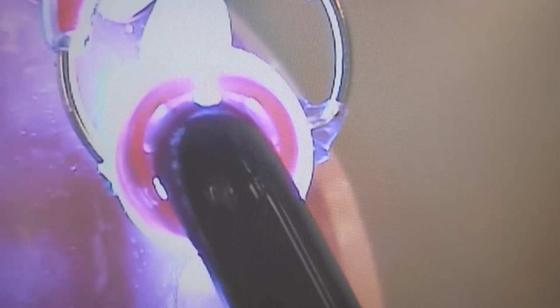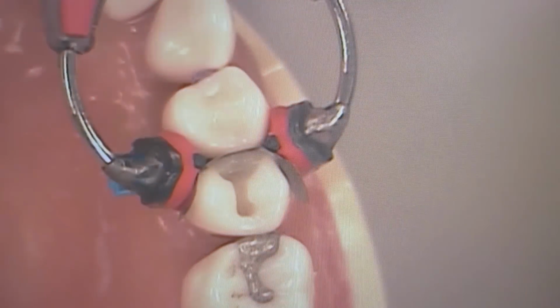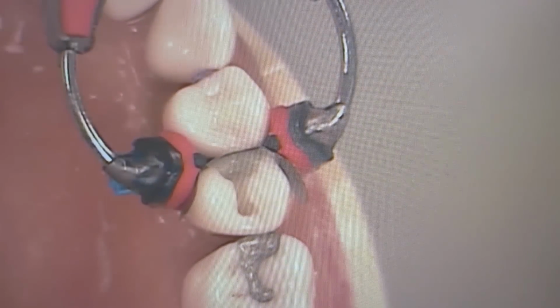Okay. Do you always do buccal first? I do whatever is easier for me. So in case it's just a buccal problem. Okay. So it doesn't matter if you do buccal or lingual first. Whatever is easier for you. Let's do that first.